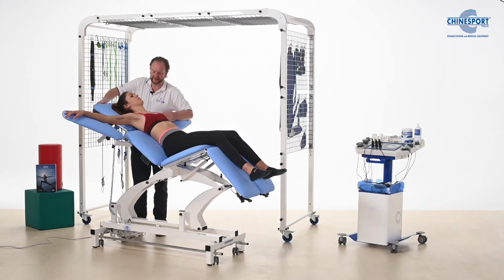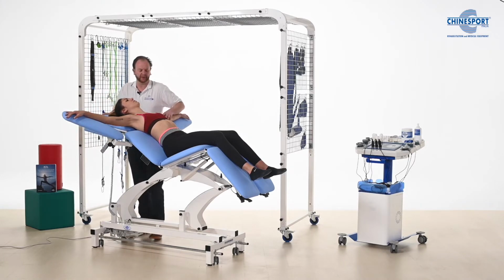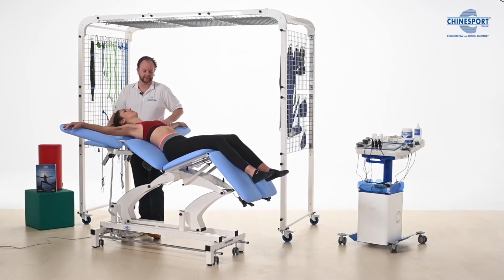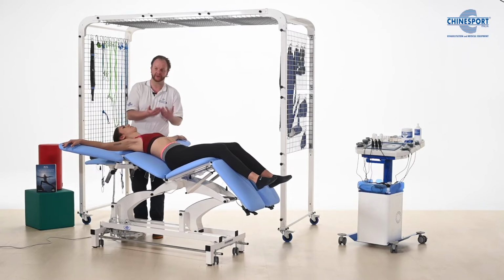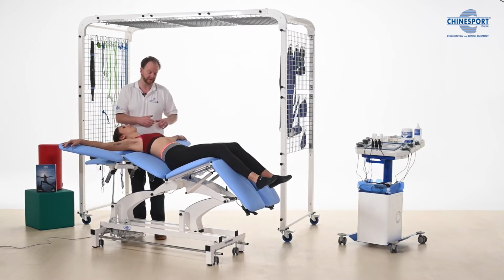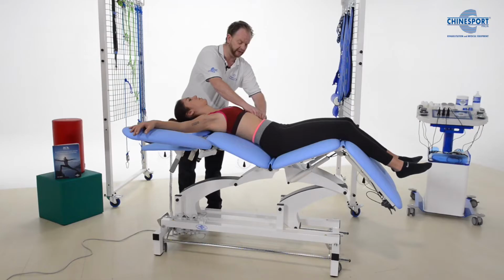We can go down a little bit. And we can focus on the abdominal breathing. We can provide some more stretch. And if you want, at this point in time, we can also use some manual therapy. And we could, for example, just release the diaphragm, breathe in and breathe out. We just hold for a few minutes here as she breathes in and breathes out.